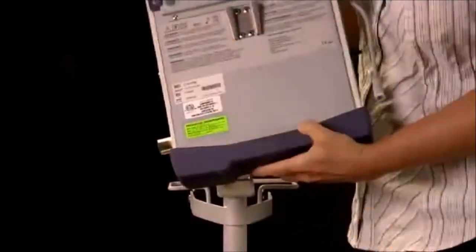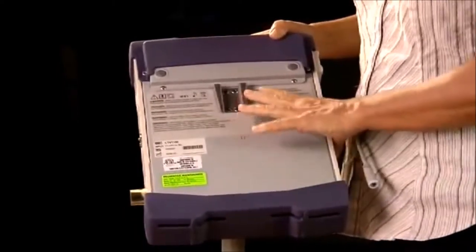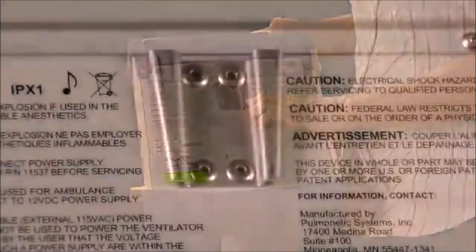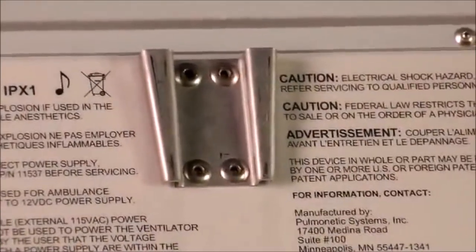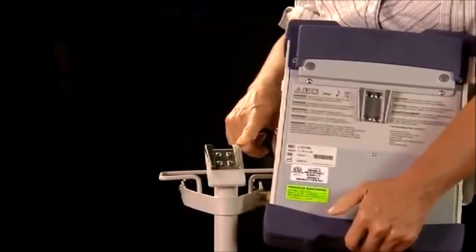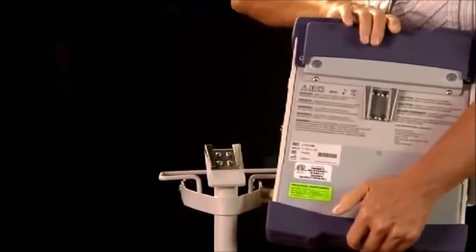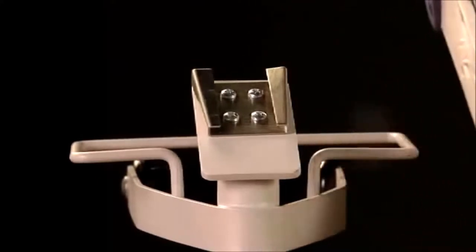Let's start by taking a look at the external features of the LTV 1150. On the rear of the ventilator, there is a compartment where the internal battery is housed. You can also see the mounting bracket. This dovetail bracket slides into the corresponding bracket on either the table stand or the pole stand. You can also purchase just the dovetail bracket to mount the ventilator on a wall, bed frame, or on the back of a wheelchair.